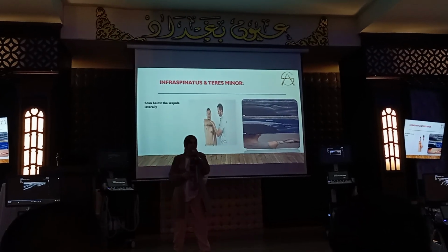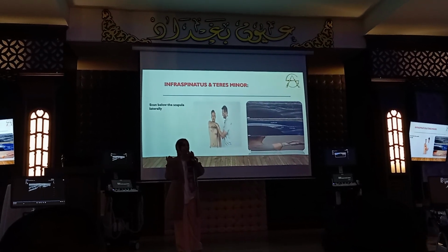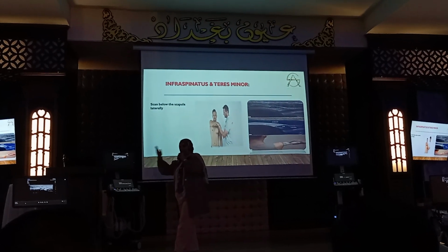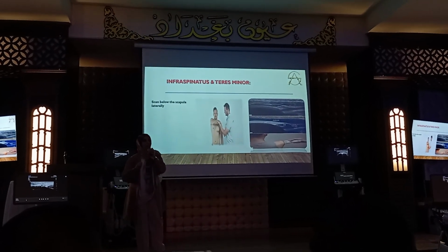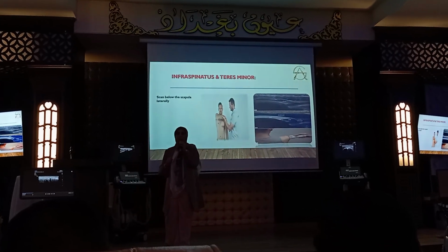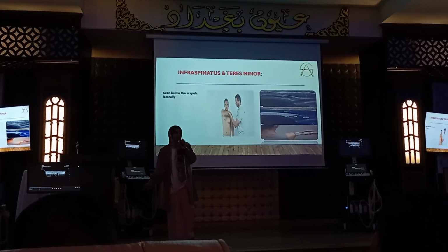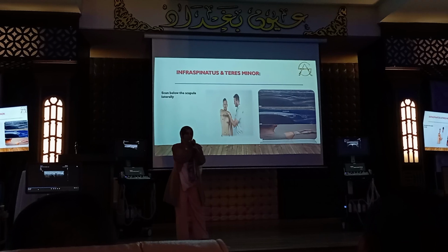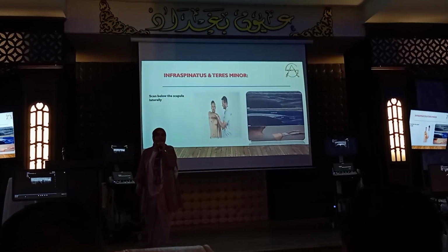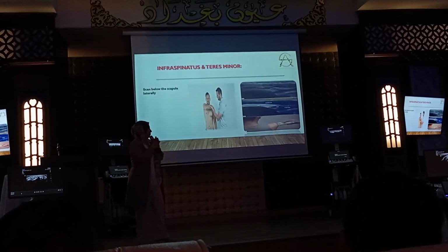How to do the dynamic movement of this muscle? What's the action of infraspinatus? It also inserts at the middle facet of the posterior surface of the greater tuberosity. So it is outside. Its action is external rotation. How to examine it? By doing movement against its normal action. Its action is external rotation, so I do internal rotation. Now I understand, I don't just keep these steps. It is not like steps. We should understand why we do this movement.